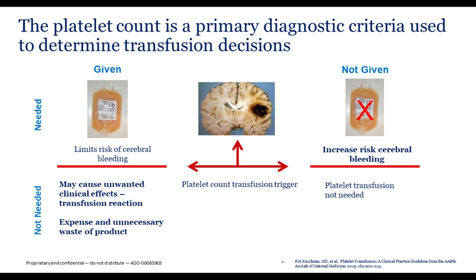With the impedance platelet count method, interferences can occur with plasma proteins, microcytes, and RBC and WBC fragmentation, and of course there's the ability to count giant platelets. No, because if you recall, only looking at size, those would most likely fall into the red cell window. So it has a low level of accuracy, we would say below 20,000. It's somewhat reliable, but again, we'd recommend reviewing the smear before any platelet transfusion would be administered.